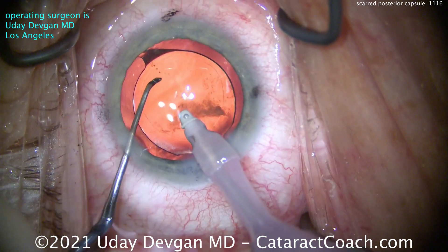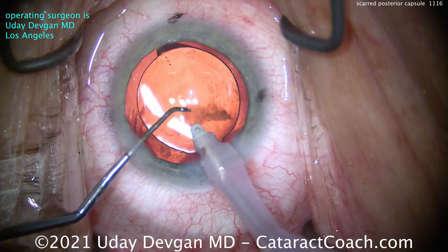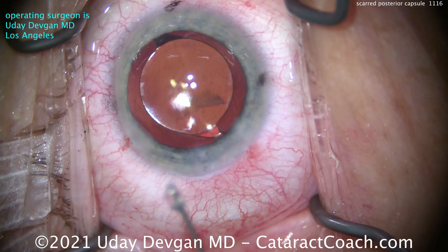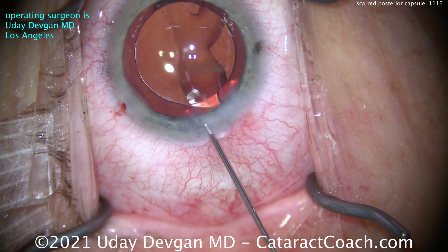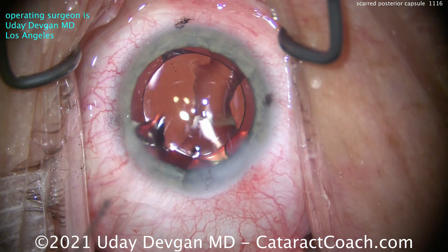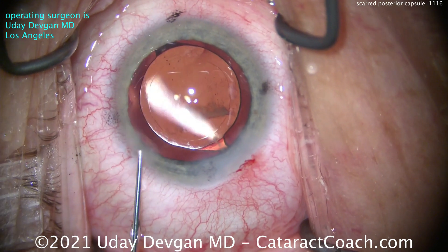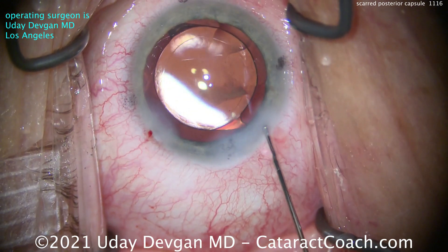Removing all viscoelastic — the capsulorhexis looks ideal. We'll dial the lens over a little bit. I've made the decision that since we have a YAG laser in the clinic, it's easy to wait about a month and do a YAG laser capsulotomy. Waiting a month is sufficient because you'll have complete contraction of the capsular bag, and then you can do a conservative YAG laser capsulotomy. There's a good section on CataractCoach on how to do that — just search the keyword 'YAG' or 'capsulotomy.' This case looks great and the patient is going to be very happy.